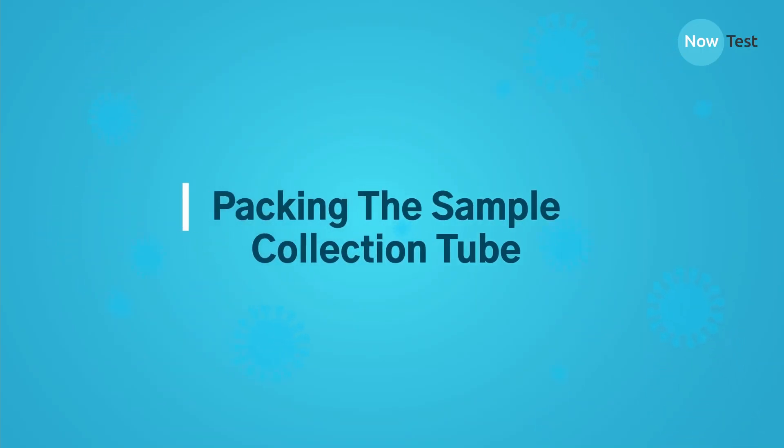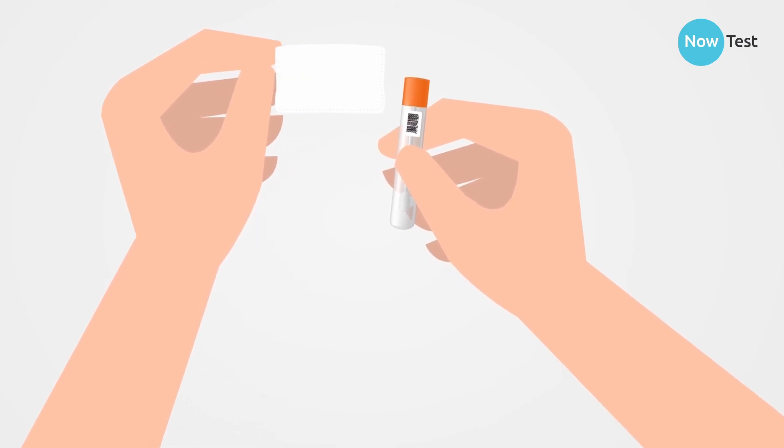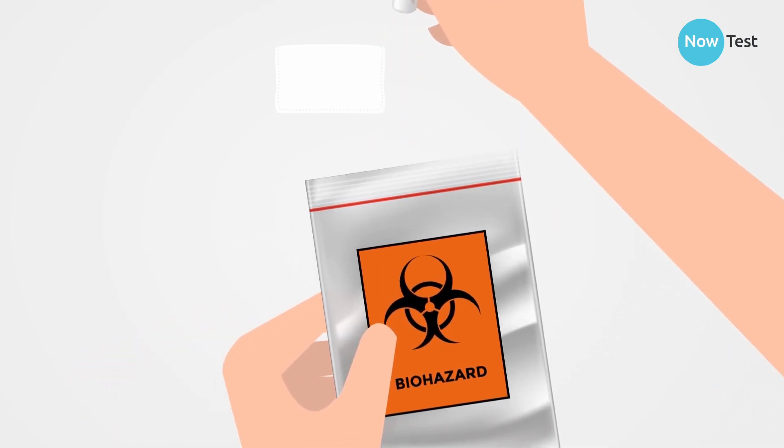Your sample collection tube needs to be packaged according to regulations for safe transit. Place the sample collection tube and absorbent pad inside the biohazard bag and seal.